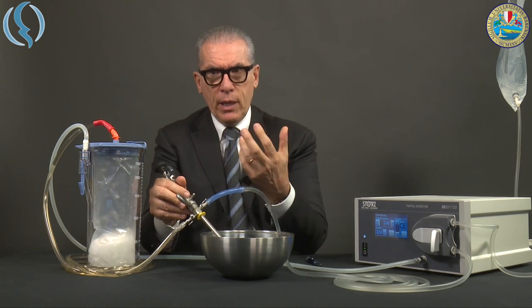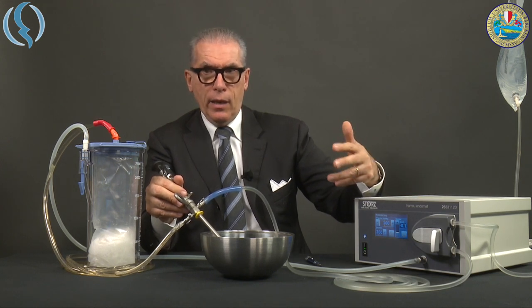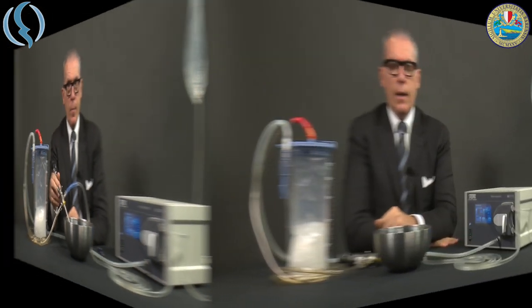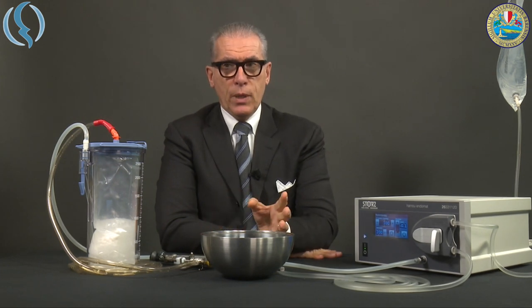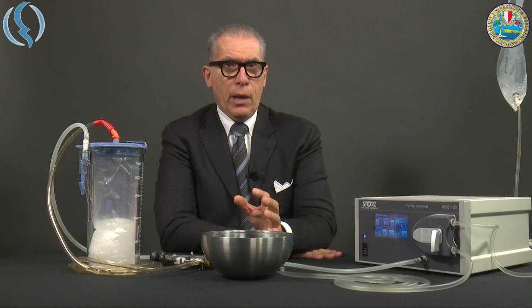In conclusion, the big difference between the old version and the new version is the LCD screen, which is a modern update. But the major improvement is the irrigation connection, which is much easier than before. I would also like to remind you that the setup differs if you want to use the Endomat designed for the resectoscope with an office hysteroscope — size 5 or size 4 of the Bettocchi.